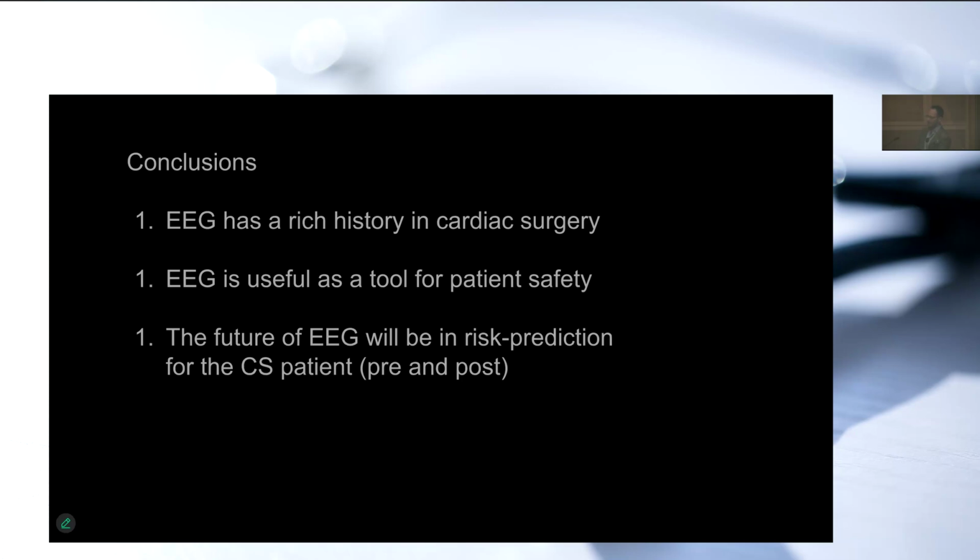So we will see. There are a few groups in Germany and one group in the US that are doing this in a big way, and they're publishing stuff at a relatively fast clip. So I think that probably in the next 5 years we'll have something that will appear in the next iteration of one of these devices we have. I have it on under the table advice, I guess, from someone that it will be a feature of the next SedLine device, which is a Masimo device that we have here, right? Yeah. So in the next version of that, there will be something like that. That will be a predictive tool to say, well, this patient based on this phenotype appears to have the following risk of delirium postoperatively. It'll spit out a probability for you. So it's exciting.